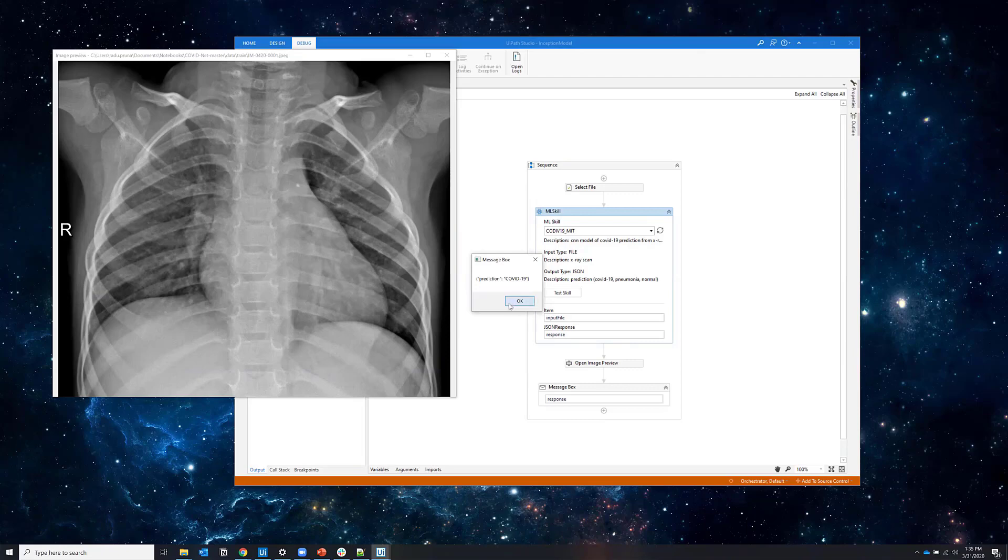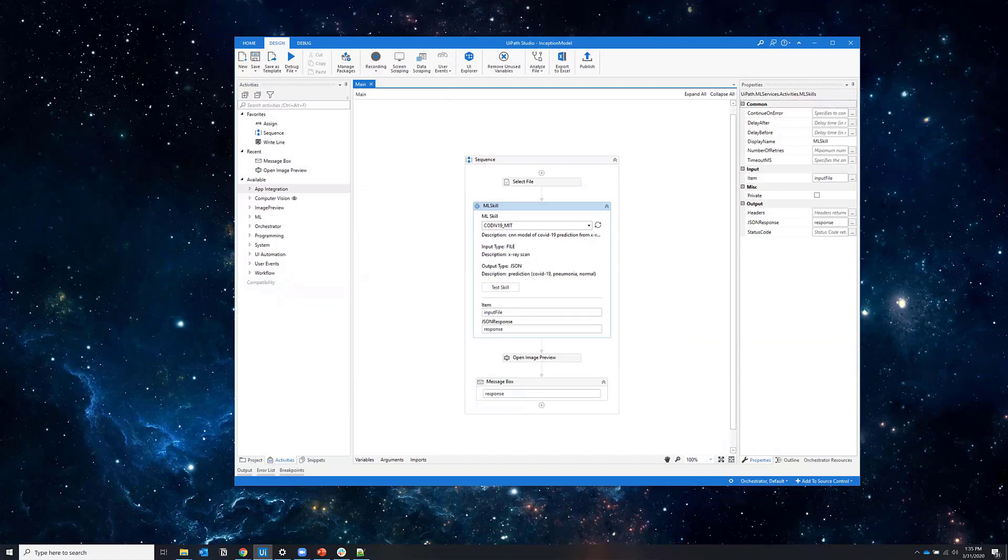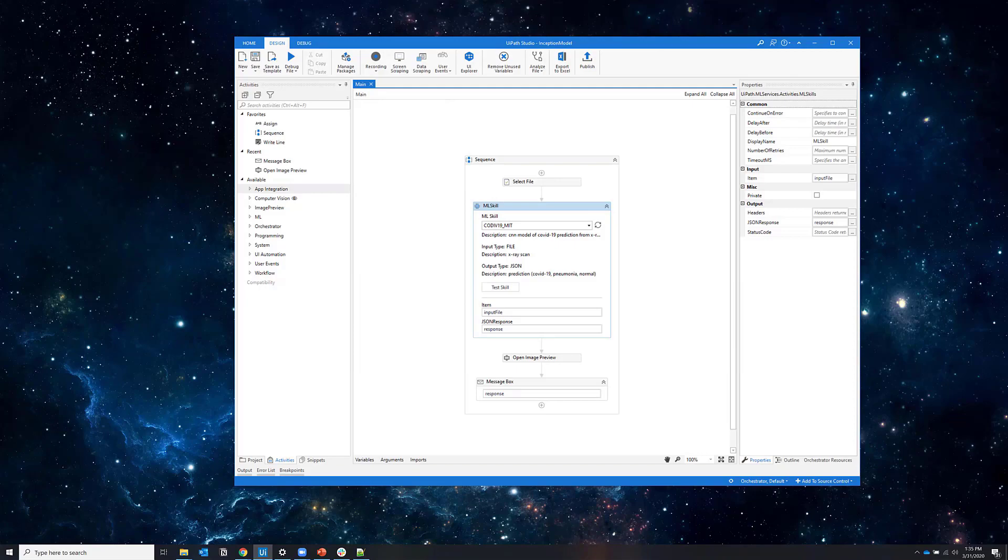Please note that this is not a production ready solution and it hasn't been validated by any external health organization. It is just a preliminary experiment that obviously lacks x-ray data.